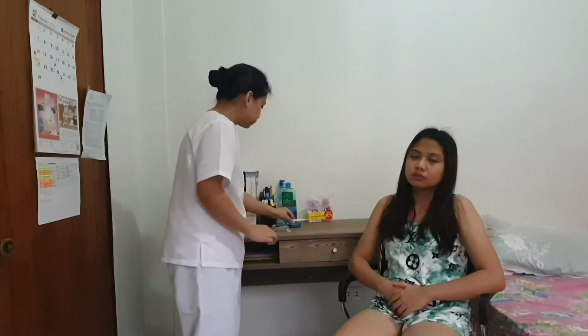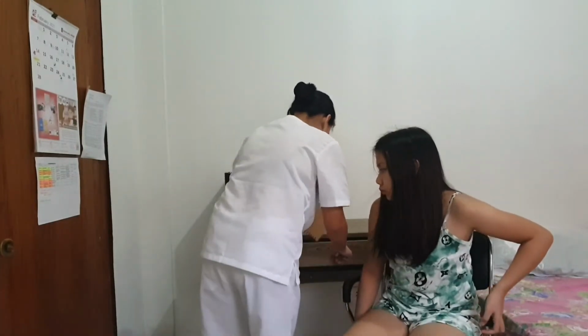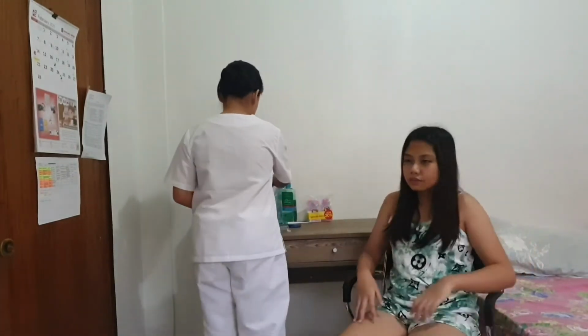Okay, thank you so much, ma'am. I will just record it on my worksheet. Excuse me, ma'am. Okay, your temperature is 36.2.